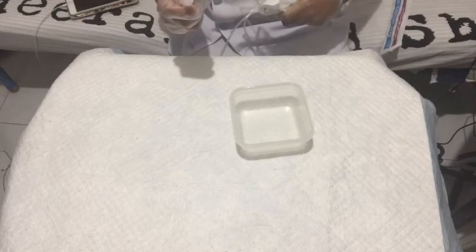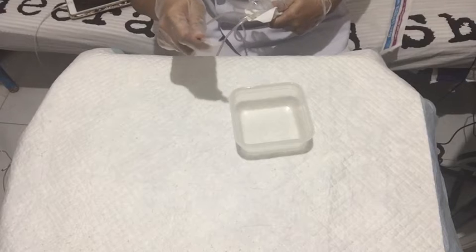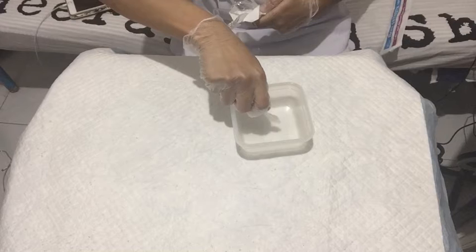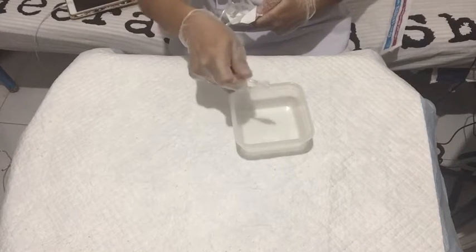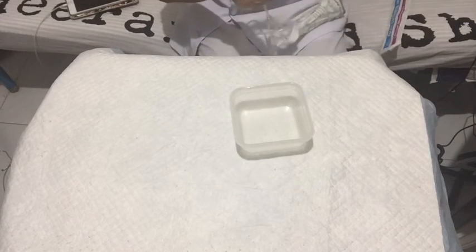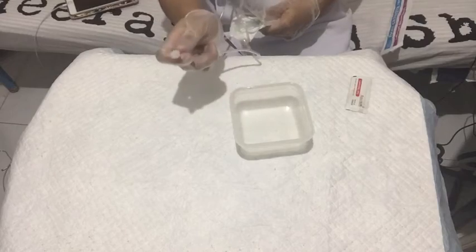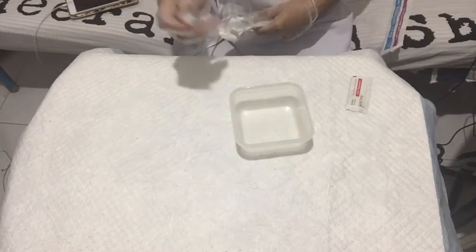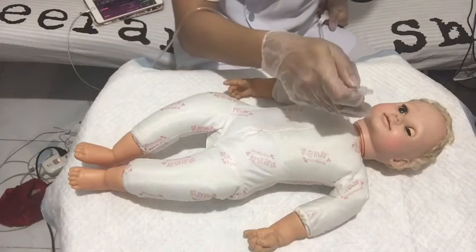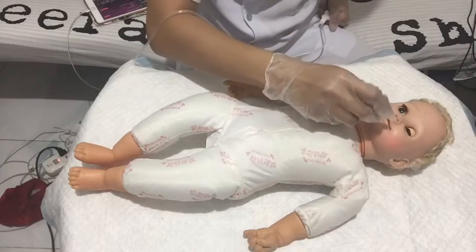Now, we're going to wrap the sterile catheter around the dominant hand and start suctioning the sterile water. From that, we can put lubricant if necessary, lubricants like this. But sterile water is what we're going to use on the baby. So now this is my catheter. It can be put either in the nasal or the oral route. In this case, I'm going to be putting it in the oral.